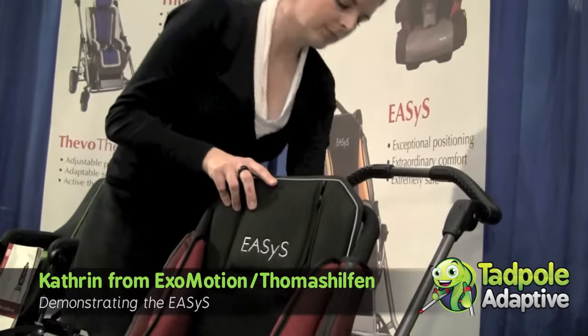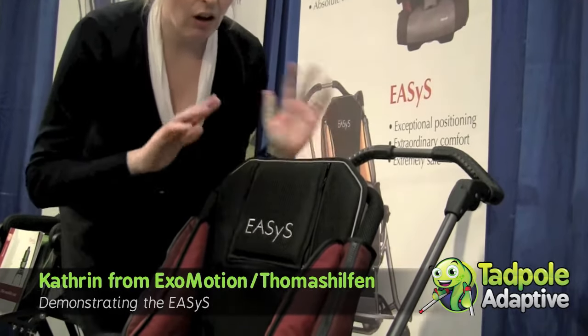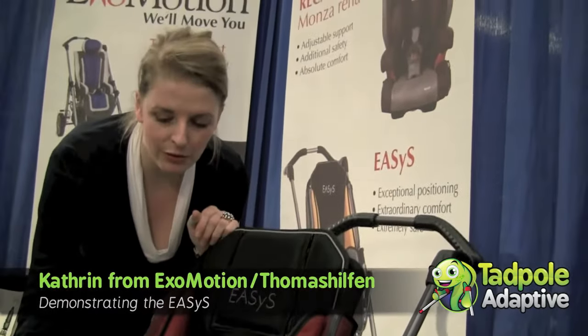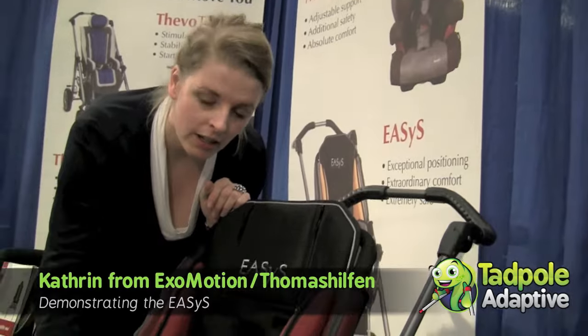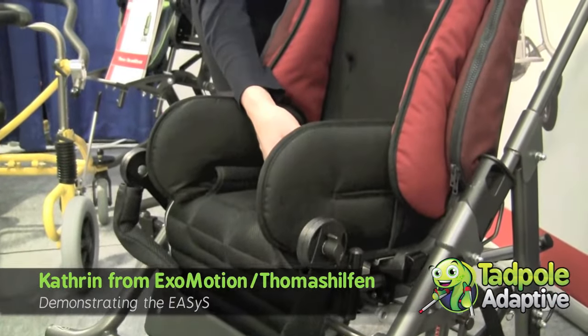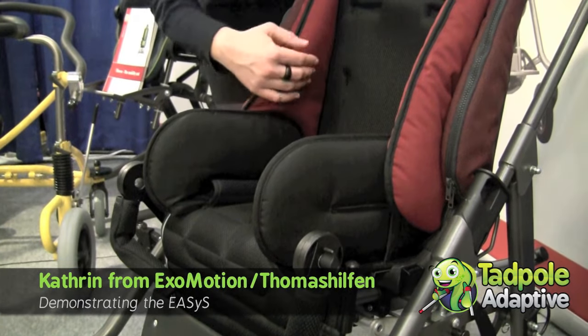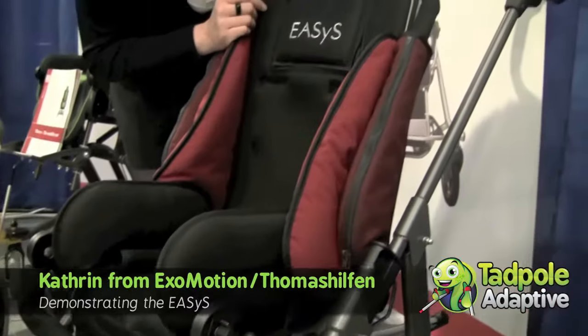You can get all types of different accessories for it. So you can get an adduction block, a two-point pelvis strap, a four-point pelvis strap. We have different kinds of lateral trunk supports. And we have a nice shaped headrest.